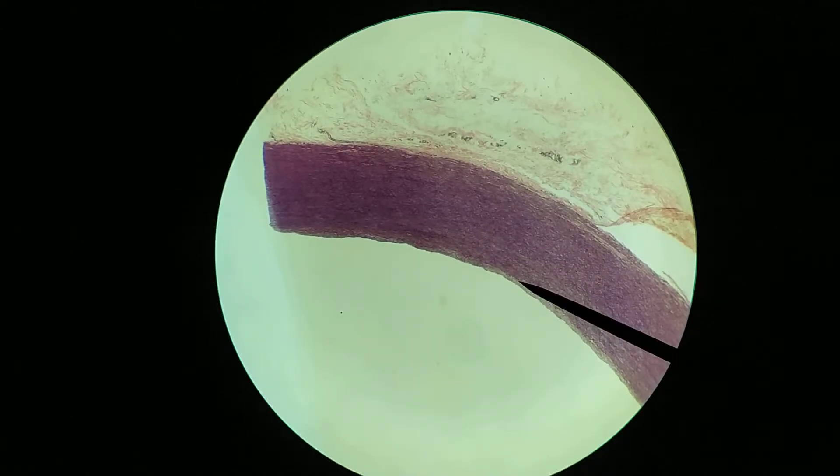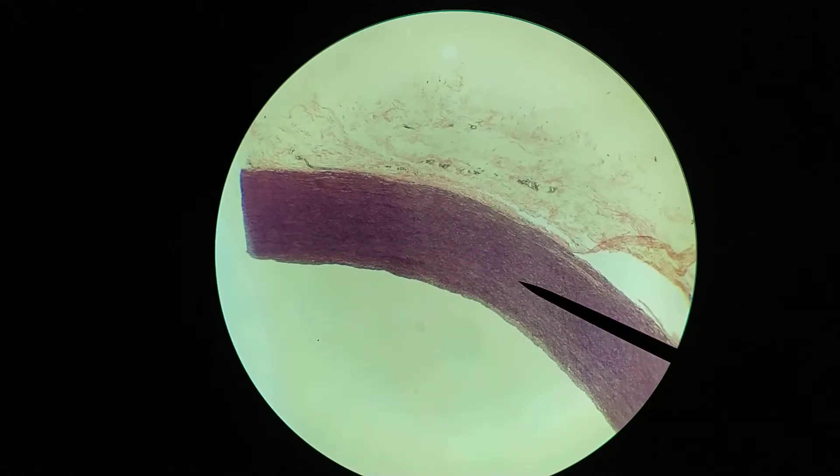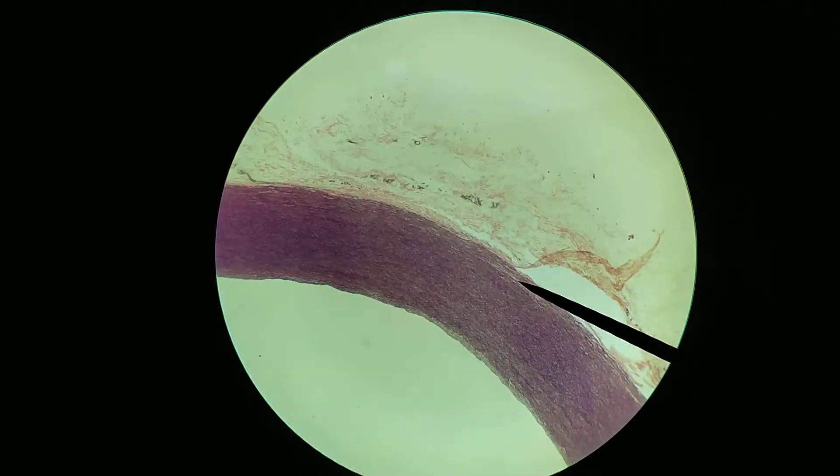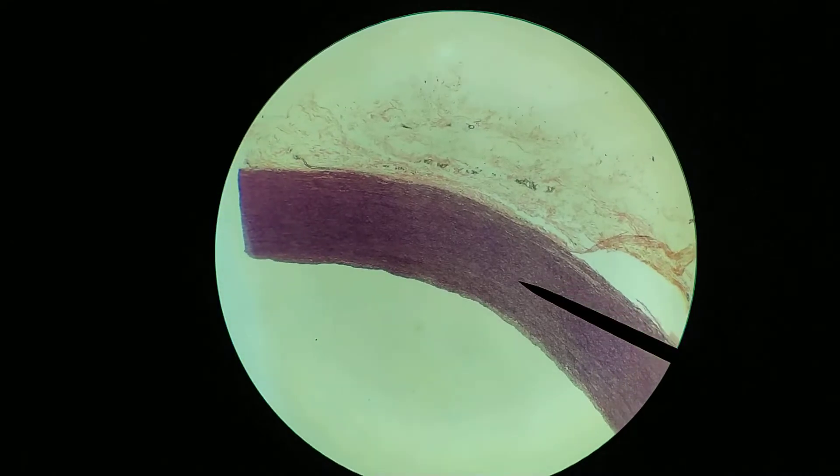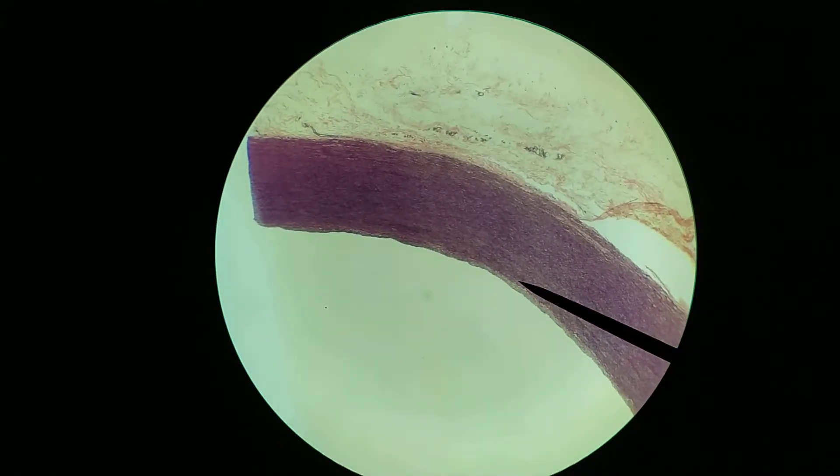And then we have the tunica media, which is this more intensely staining region, which has a lot of elastic fibers and a lot of smooth muscle. You can see it's a very thick layer in this case. This is a very thick, very strong blood vessel.